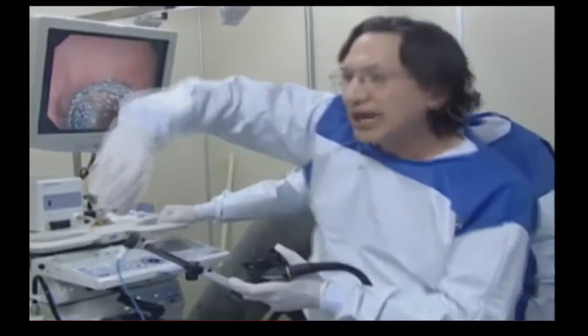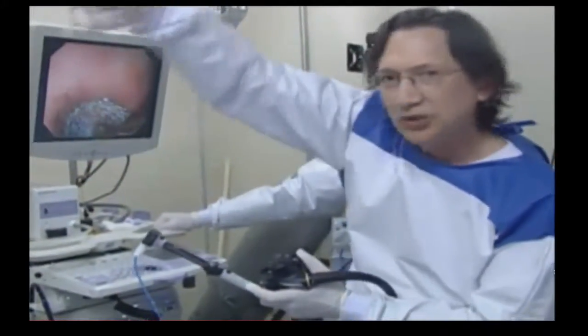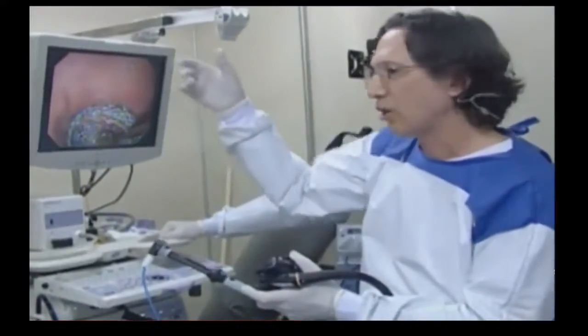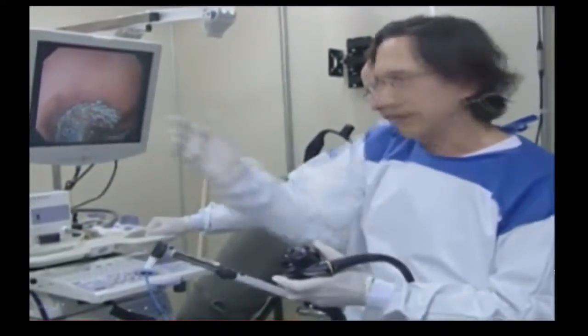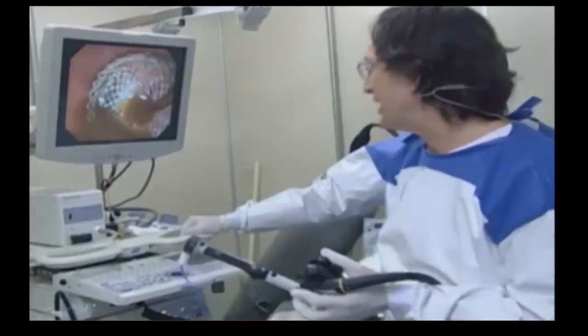It's just another side street. You have the main highway, the GI tract, and you have side streets that go to a pseudocyst or gallbladder or bile duct. That's why it's called an anastomotic stent, right?